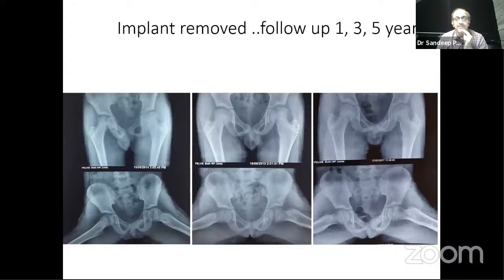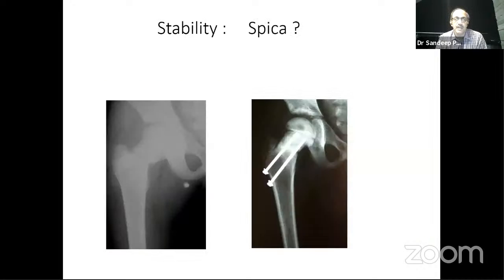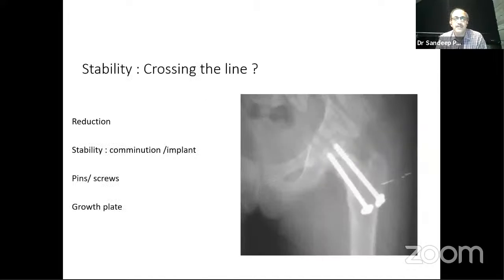This is his long-term follow-up at 5 years. A little coxa valga, but no AVN, and continues to function well. The point to be made here is that don't compromise on crossing the physeal plate. Stability is more important than trying to preserve the physis in fracture neck femur. I think that should be the takeaway message. In older children, also look at the Pauwels angles. A couple of screws placed like this are of no use because they tend to cut out. Stability has to be augmented if you're using only cannulated screws, with a spica as a mandatory prerequisite. Never leave them without an additional protection.